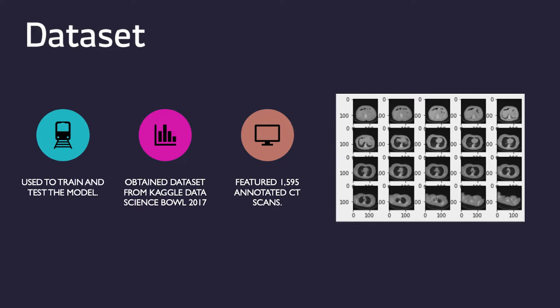kept completely private. In order to train and test our system, we must feed it into a sufficient and applicable dataset. Our dataset was retrieved from Kaggle Data Science Bowl 2017, in which it consisted of 1,595 annotated lung CT scans, comprised of cancerous and healthy scans.